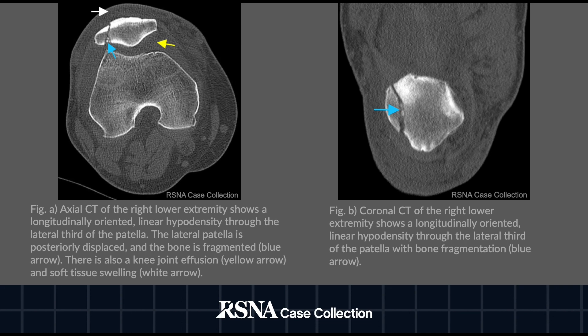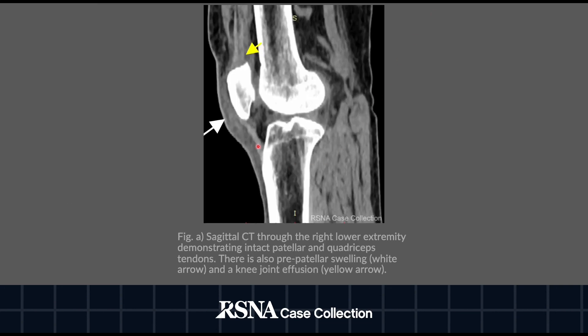The image on the right is a coronal CT of the right lower extremity demonstrating the same linear hypodensity seen in the prior images. Bone fragmentation can also be appreciated along the lateral facet of the patella, indicated by the blue arrow. The sagittal CT through the right lower extremity demonstrates intact patellar and quadriceps tendons, in addition to pre-patellar soft tissue swelling indicated by the white arrow and a knee joint effusion indicated by the yellow arrow.